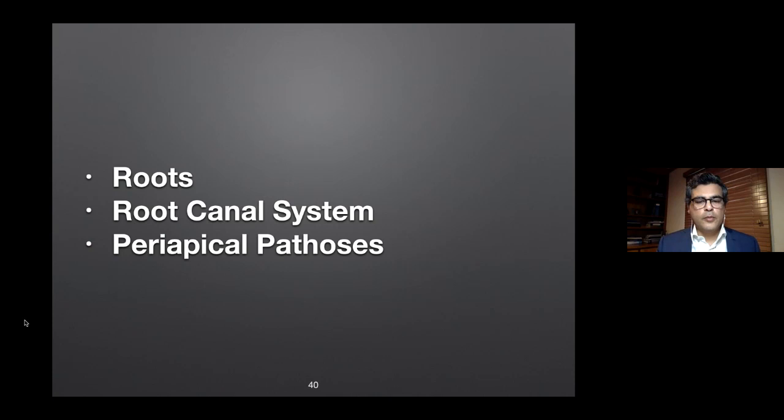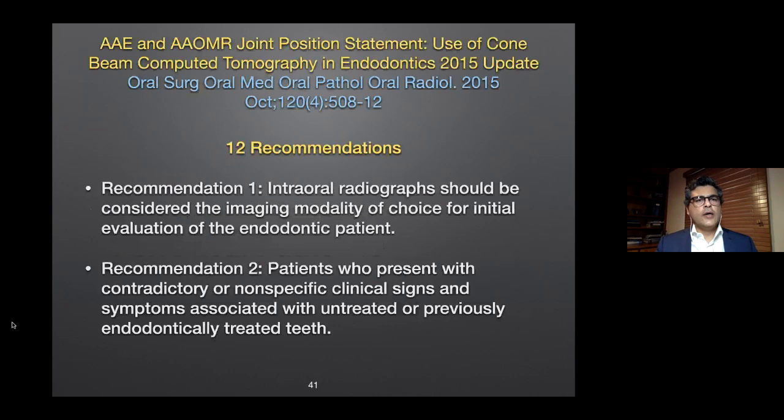These are fairly common indications for patients to come to your practice and for you to image them as part of your diagnosis and treatment planning process. I'm going to start with a joint position statement by the American Association of Endodontists and the American Association of Oral and Maxillofacial Radiology. It was published in 2015, so about 5 years ago. They have 12 recommendations, and not just about cone beam CT; they cover all the imaging modalities and give specific recommendations regarding use of cone beam CT for endodontics.